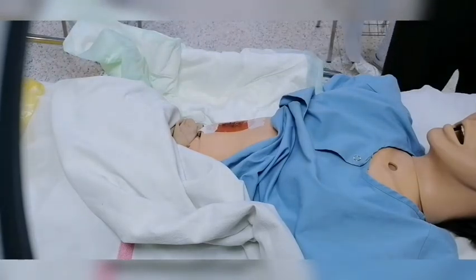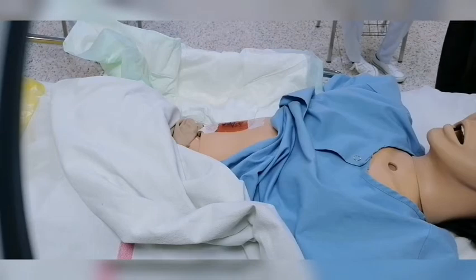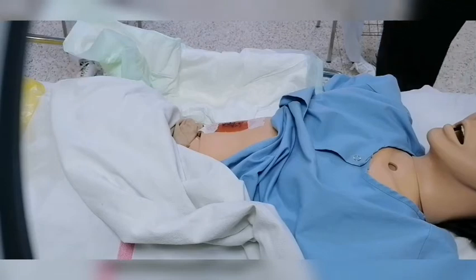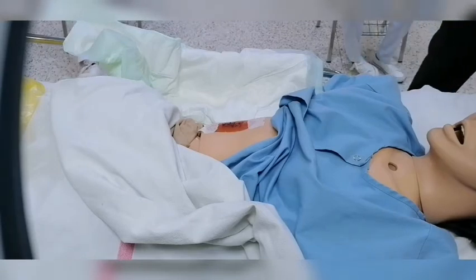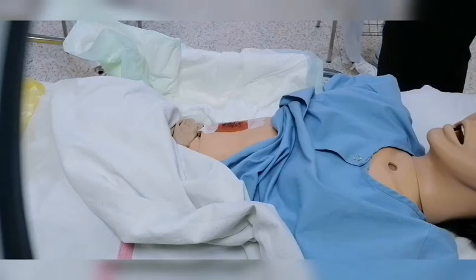I can have some assistance from others. It is better always to do the dressing with two persons. One of them will help you with the non-sterile equipment. Because when you handle the solution, the outside of the solution bottle is non-sterile. So if I am wearing sterile gloves and then I touch that solution or antiseptic solution bottle, it means that my hand is becoming unsterile.